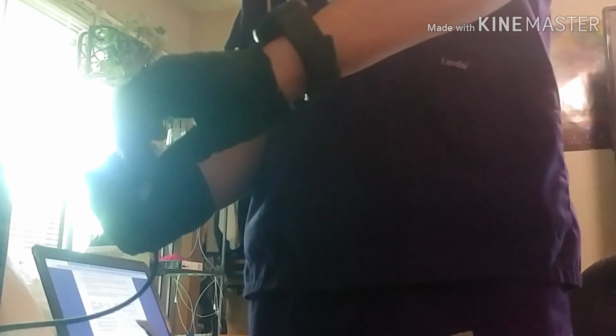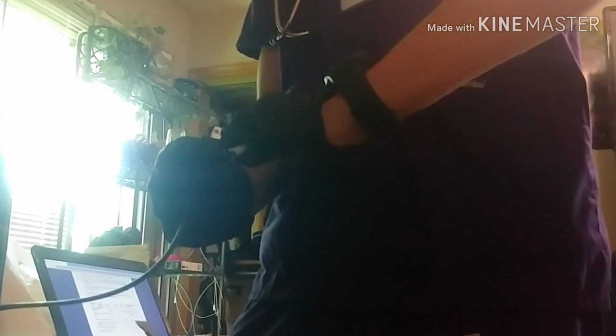Alright. That went good. So what we're going to do is flush it last because there's still a little bit of medication here in this line. So I'm going to rub it for 15 more seconds. And then we're going to be just about finished up. Okay. And here, this is the final flush, and this is going to be 3 milliliters, just like the first one. But this first milliliter needs to go in at 1 milliliter per minute. The second 2 milliliters can go a little bit quicker. That's fine. So we're going.